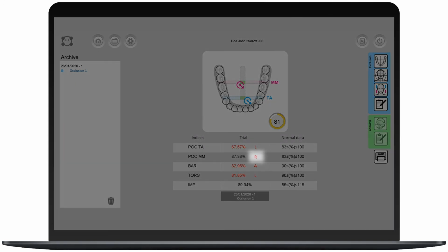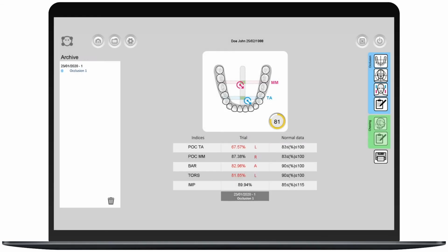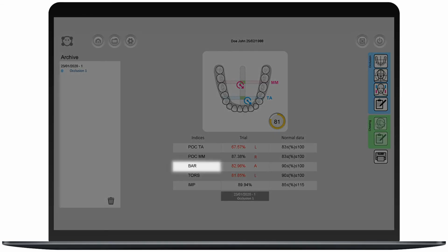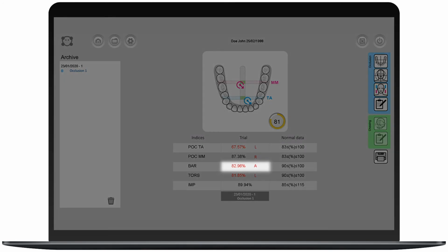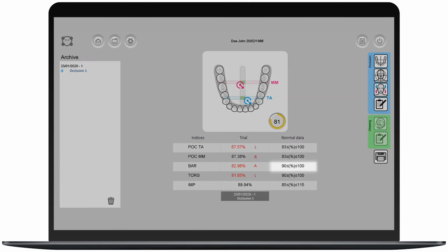The letter R indicates that the right masseter is working more than the left. The occlusal barycenter is calculated by comparing the activities of both temporalis versus both masseters. In this way, we can understand the prevalence on the sagittal plane. In this case, the barycenter is 82.96%, which is outside of the normative range.